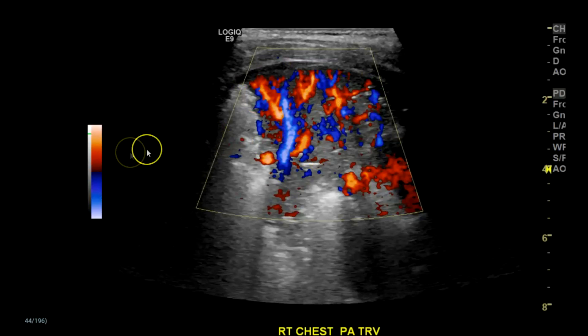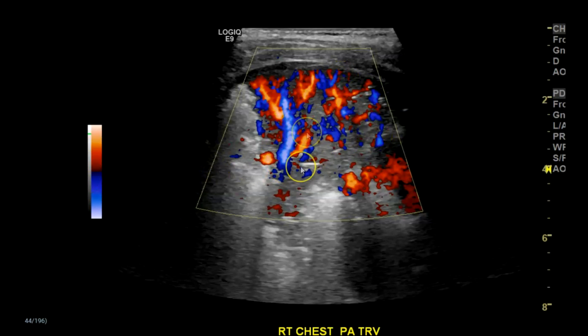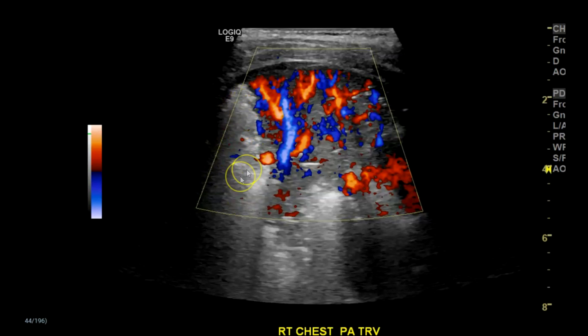With color Doppler — actually I'm using power Doppler here with a different color envelope — you can see the vascularity of the lungs, very vascular. And then the parts with air, you're not going to pick up color Doppler.